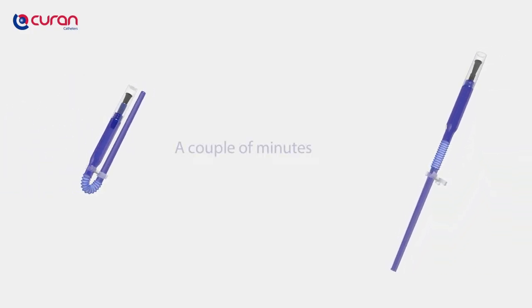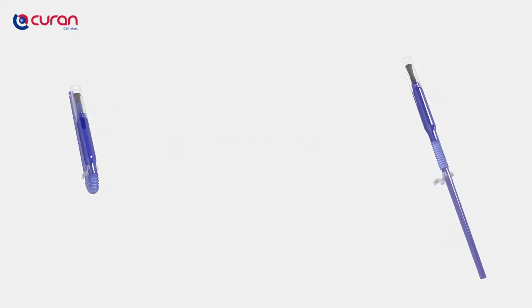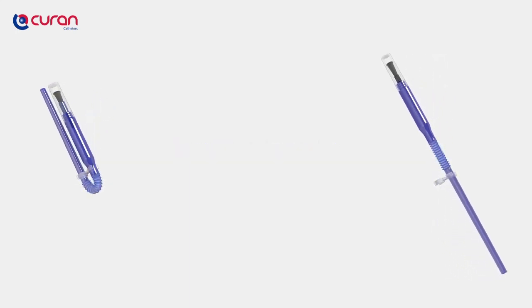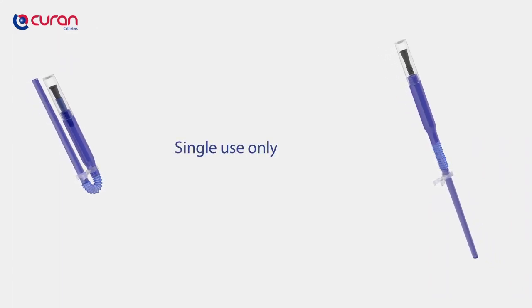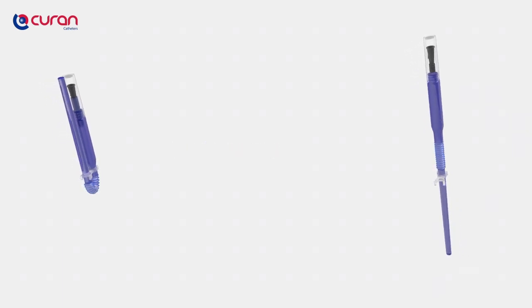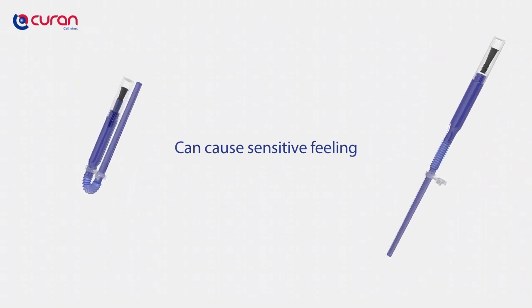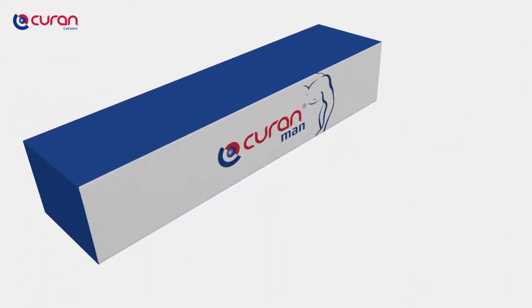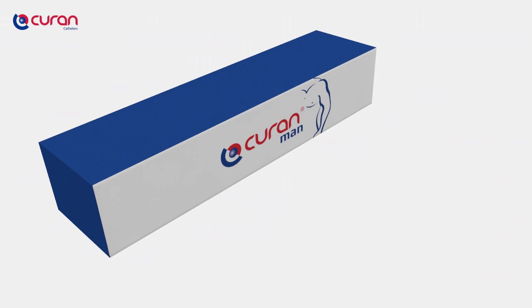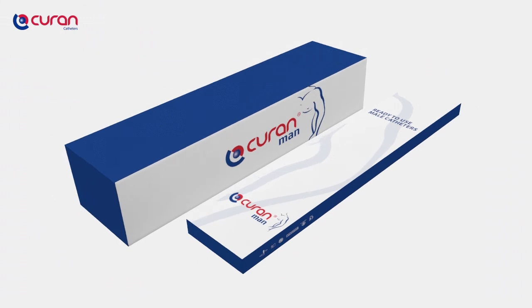Intermittent self-catheterisation is a procedure that takes approximately a couple of minutes and needs to be repeated three to six times a day. The catheter is packaged in a sterile manner and is intended for single use to ensure hygiene. The first times, the procedure can cause a sensitive feeling in the urethra. The body needs time to accept the procedure — this is completely normal. The Curan Man is available in a box of 30 or a box of five pieces, which is very suitable for daily trips or travelling.